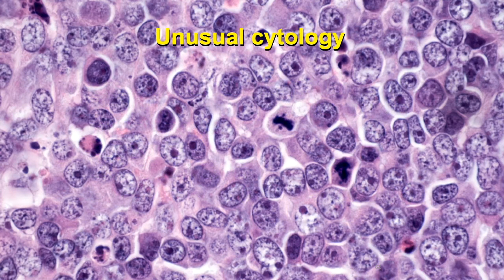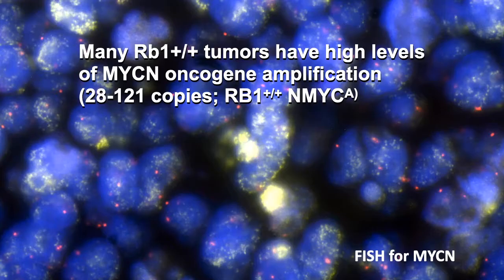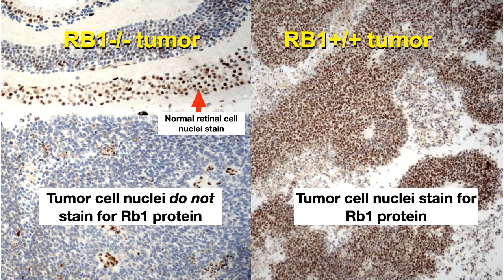This shows the cytology — the round or oval nuclei with prominent nucleoli — in a case we saw a few years ago. We can compare an RB1−/− tumor on the left with an RB1++ tumor on the right. Interestingly, RB1++ tumors seem to be driven by amplification of the MYCN oncogene. The tumor cell nuclei in RB1++ tumors retain RB1 protein, so they stain with immunohistochemical stains, compared to RB1−/− tumors which show no nuclear staining.